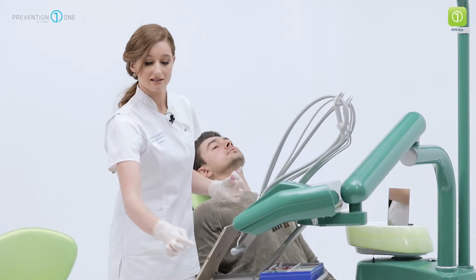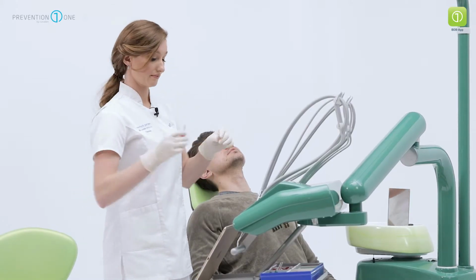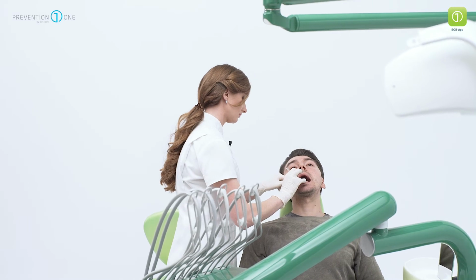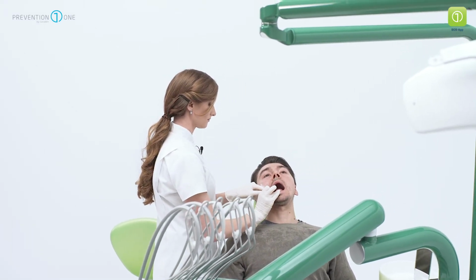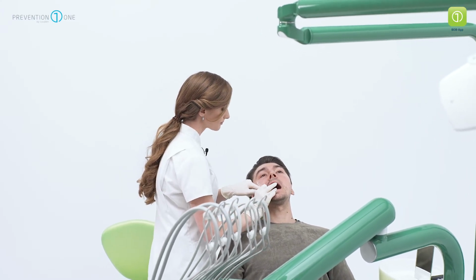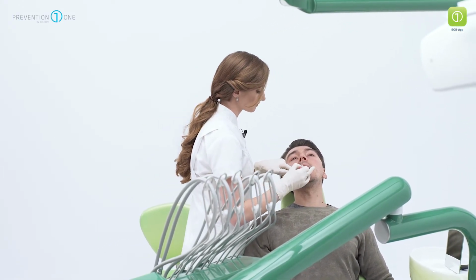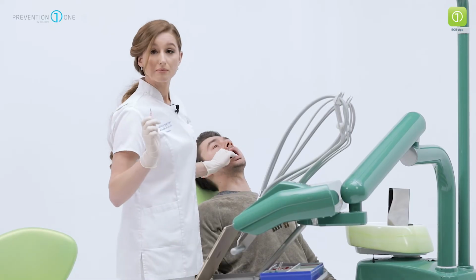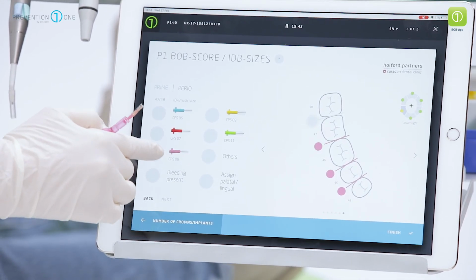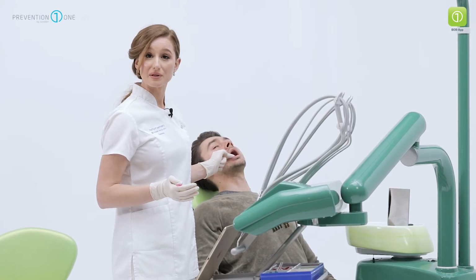Moving on to the last sextant. I know that John needs to use the pink Prime brush in the lower right sextant. By inputting the pink brush, again, I can click each area or hold the button down, which in that case will infill all the areas with pink.